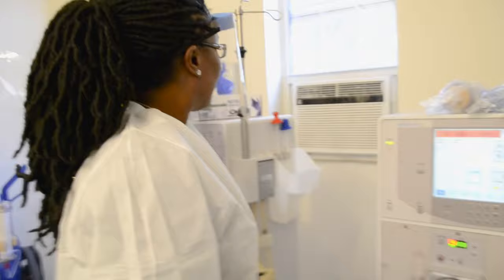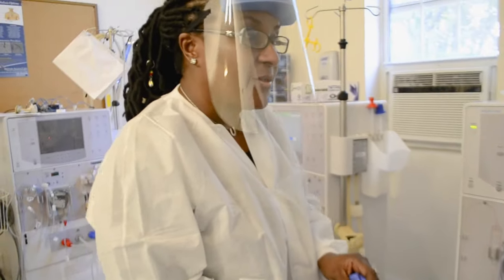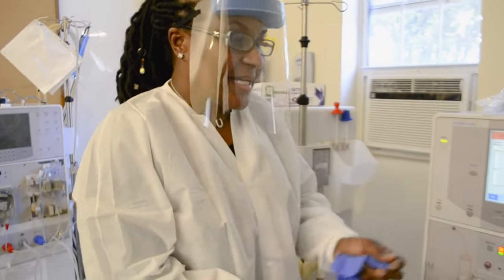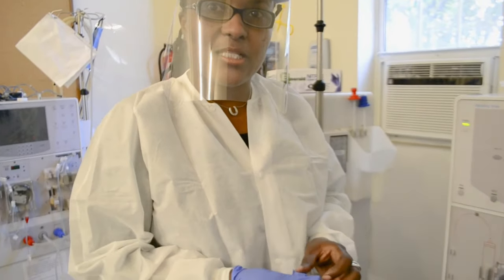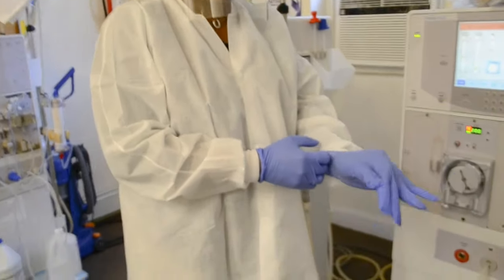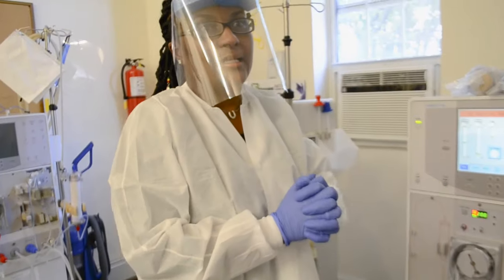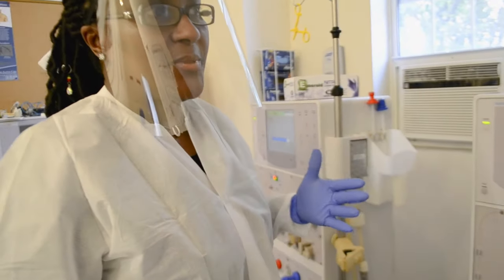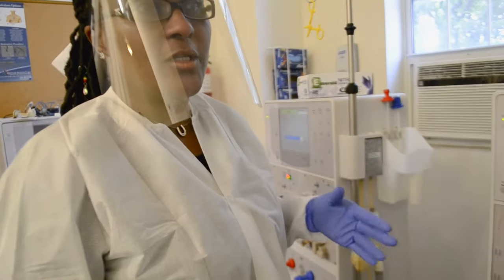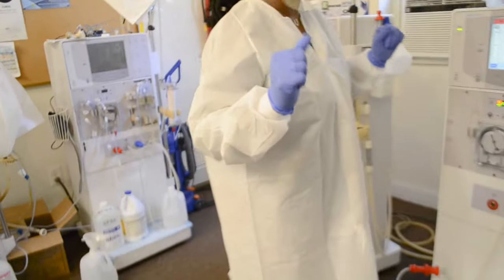Full PPE should be worn during the setup of the machine. I had to take my mask off because the sound was not clear. Just be reminded that you need to have on full PPE, which would include your shield as I'm wearing, a gown, a face mask, and of course your gloves.